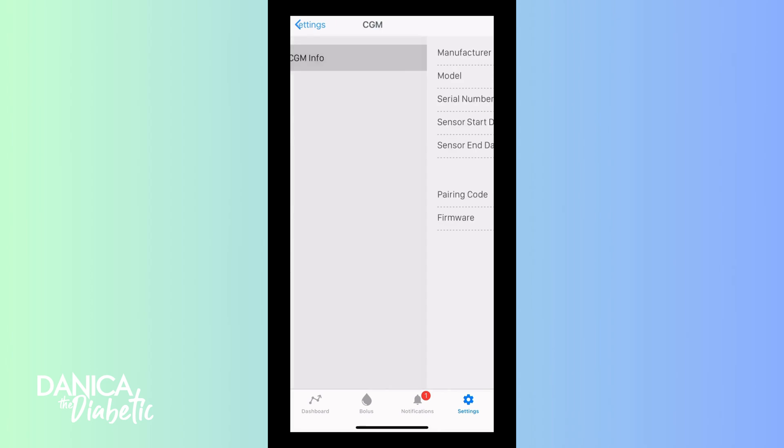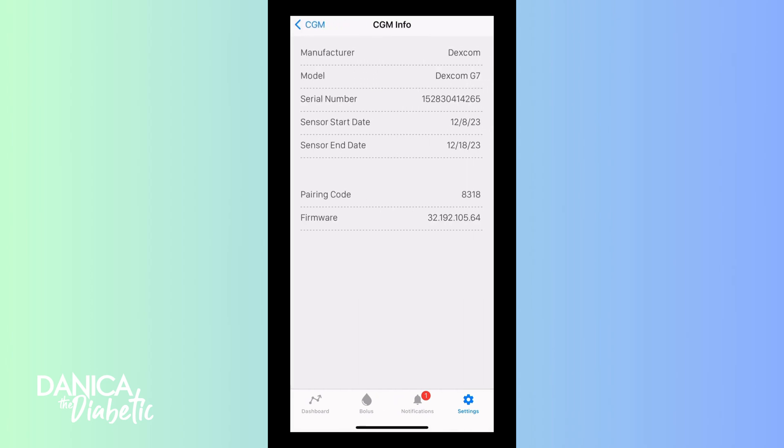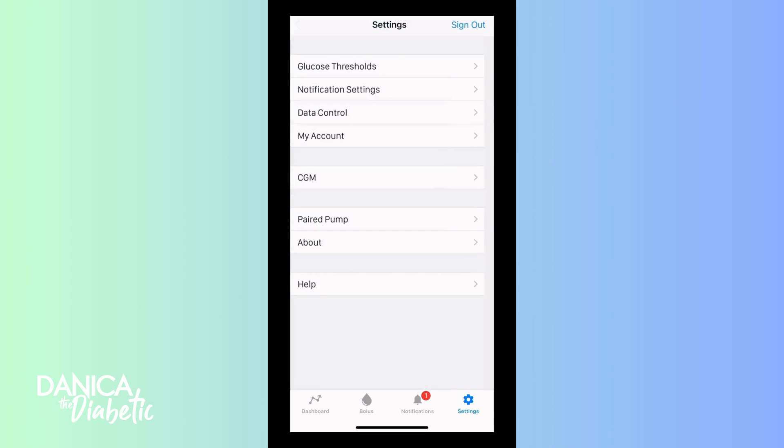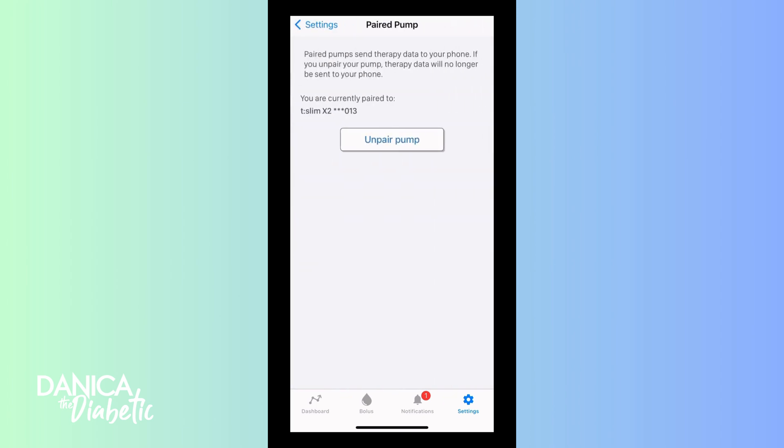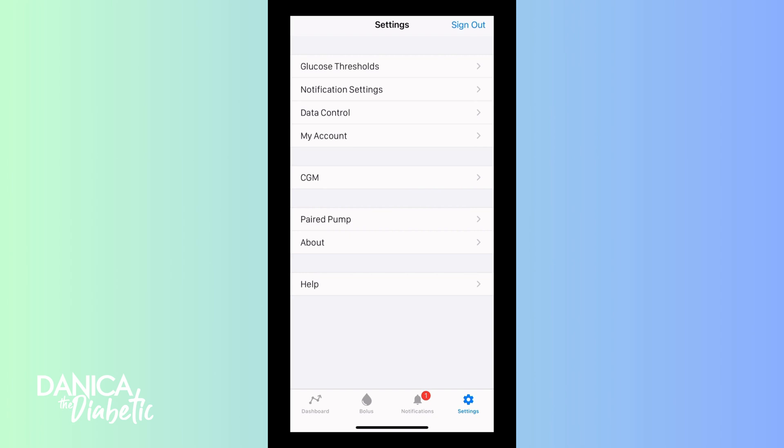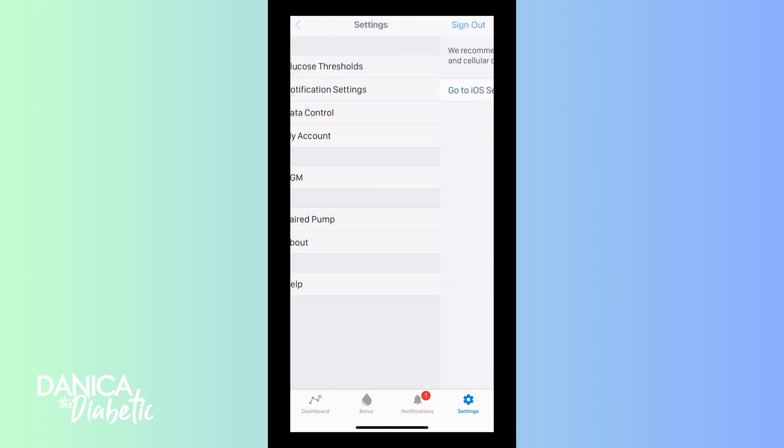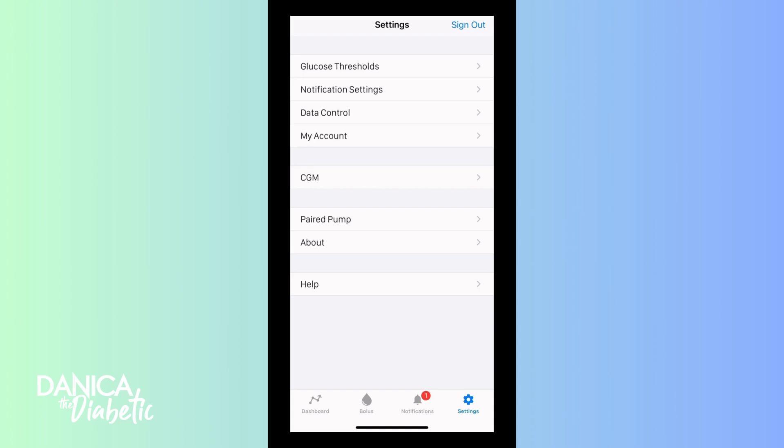Here in the app, you can get your CGM info. You can see it's a G7 and the pairing code and everything is in the T-Slim app, the T-Connect app. And you could unpair your pump. I don't think you should do that unless you need to, but the app is still pretty seamless and such a great tool for managing my diabetes.